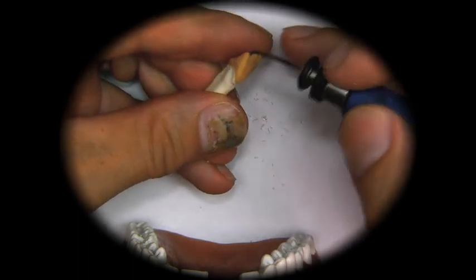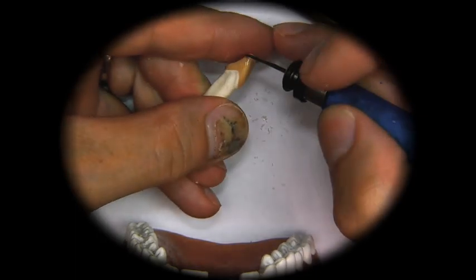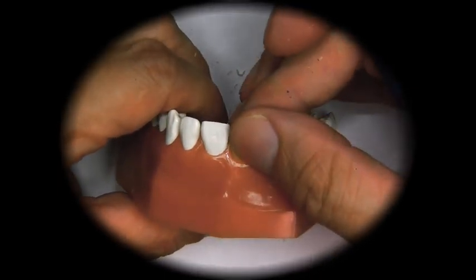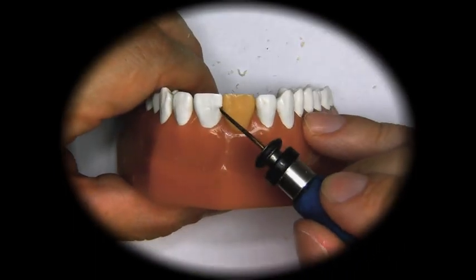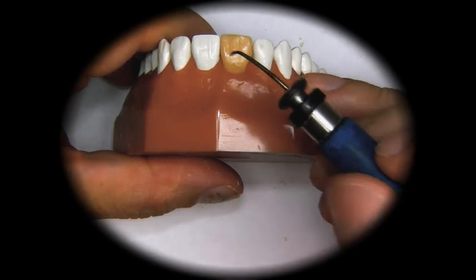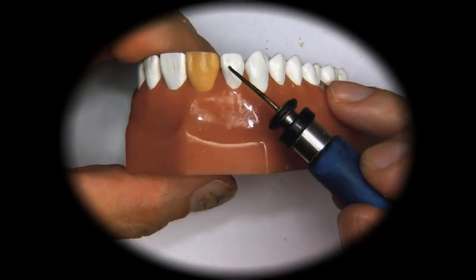We have a little deficiency at the contact area, so we're going to add a little more wax at the contact area. Before it cools down, we can push it in, and we have our contact area right there at the junction of the middle third and incisal third, and we have a contact area right here.